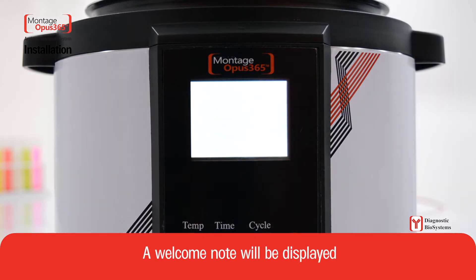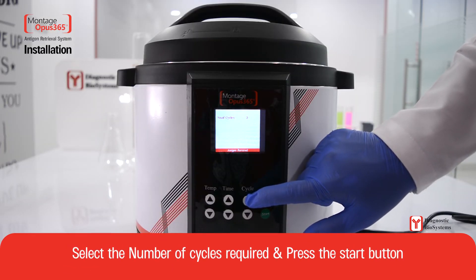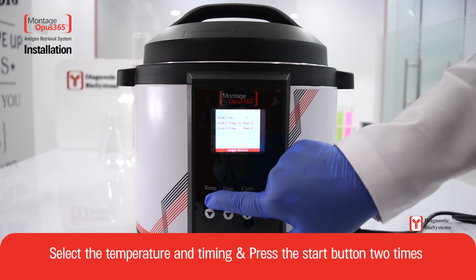A welcome note will be displayed. Select the number of cycles required and press the start button. Select the temperature and timing, then press the start button two times.